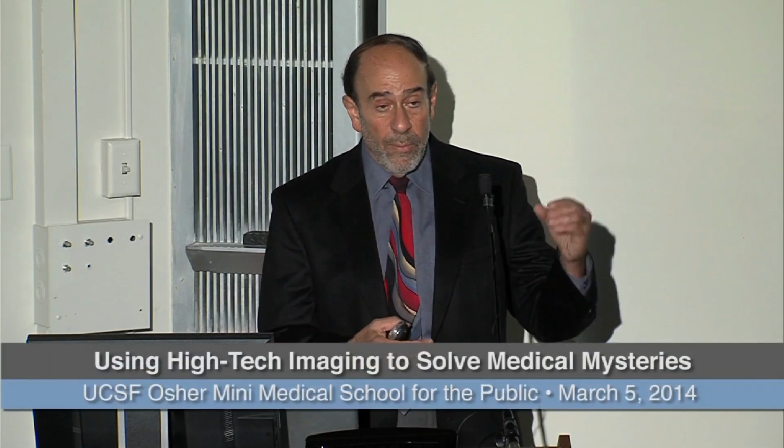Tumor ablation is where we stick something in a tumor to kill it off. It might be a probe, and we might freeze it. We might heat it up with radiofrequency. We might put a catheter in a vessel leading up to that tumor and inject something that will kill it off, like alcohol or a radioactive substance. Or we might just try to change the configuration of the tumor and shrink it down before the patient goes to surgery to make it more manageable.